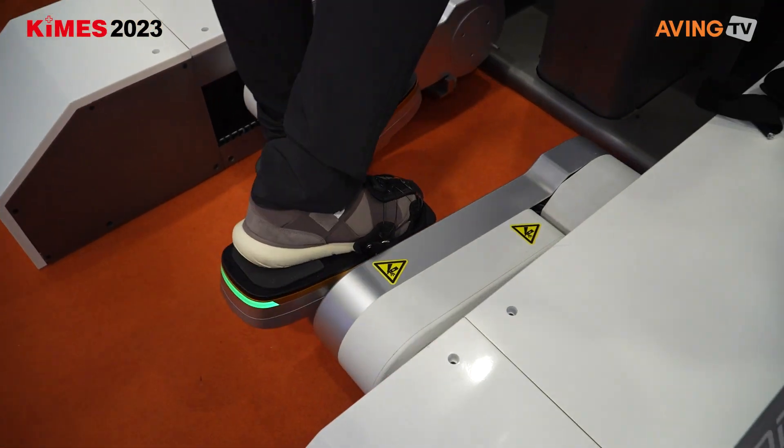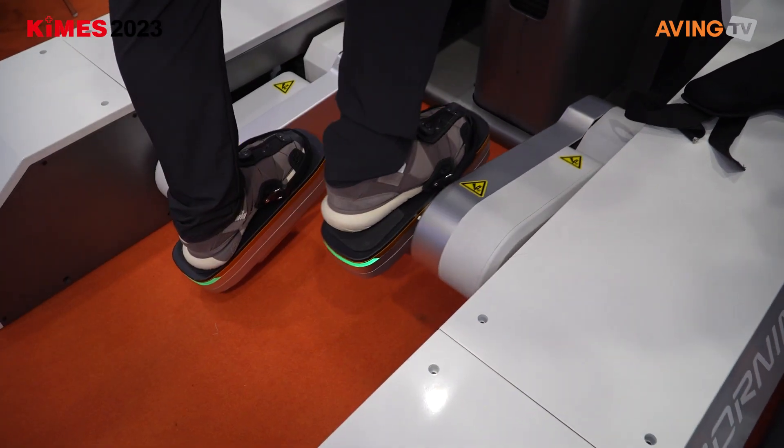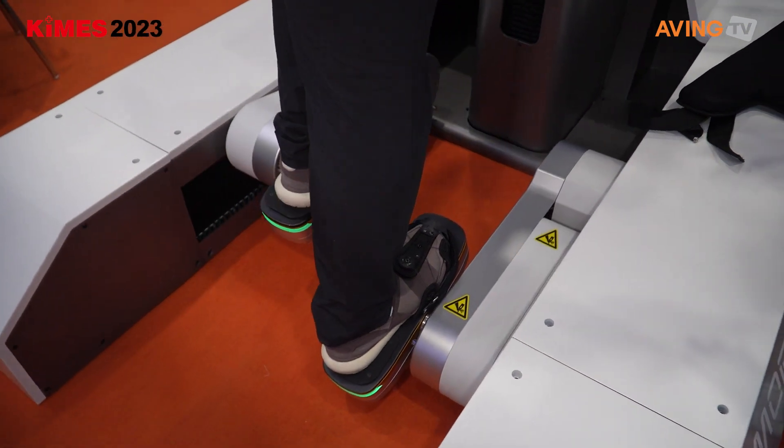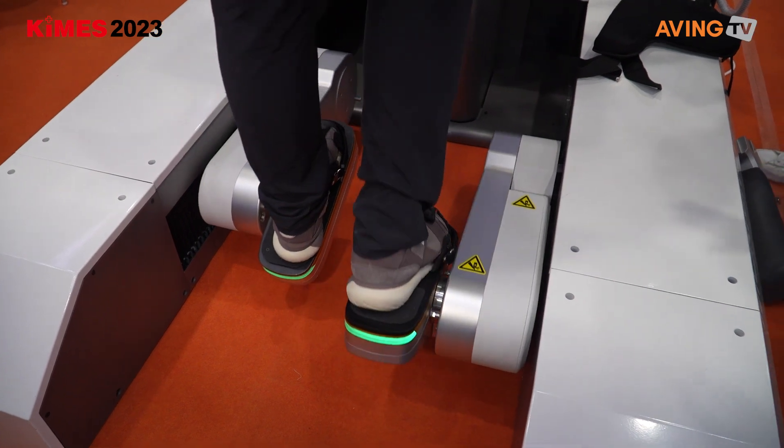As you can see here, this moves separately. In a normal treadmill, you have to move both feet together. But this one moves just separately, so you can actually put both feet all the way down or both feet up at the same time.